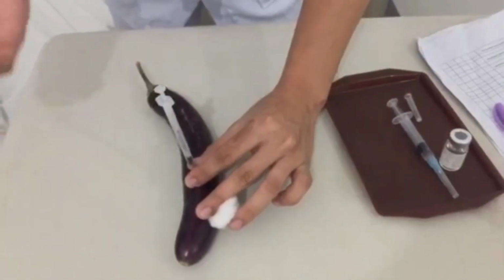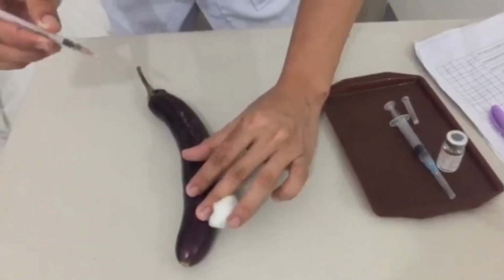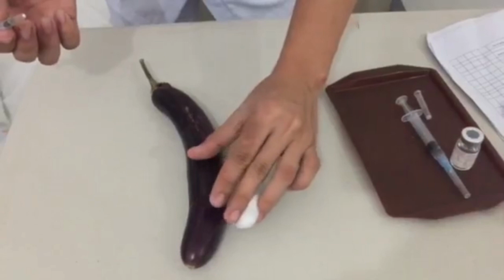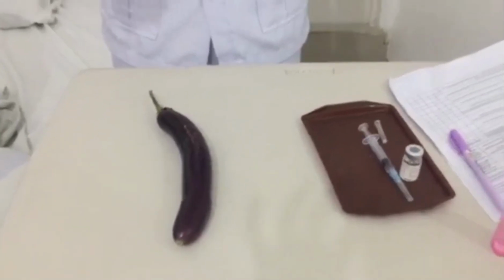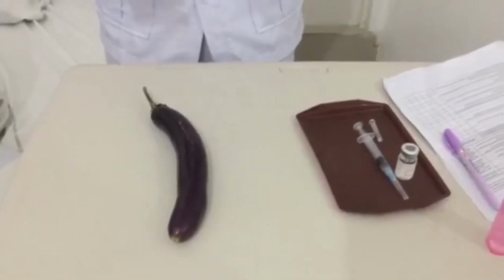And then I will remove the needle. Remove the needle smoothly, pulling along the line of the insertion while depressing the skin with your non-dominant hand. And then, if bleeding occurs, apply pressure to the site with dry sterile gauze until it stops. Dispose of the supplies appropriately.